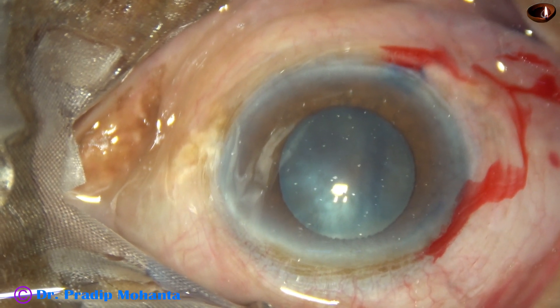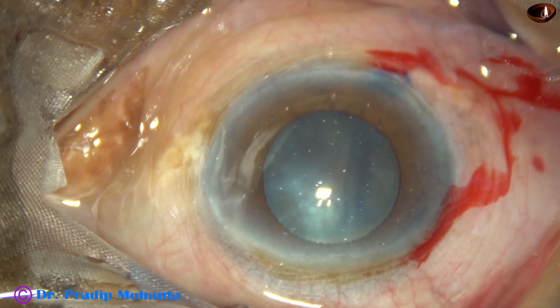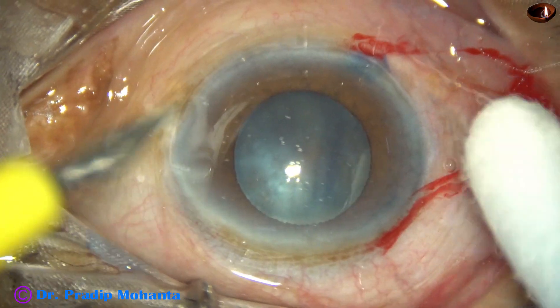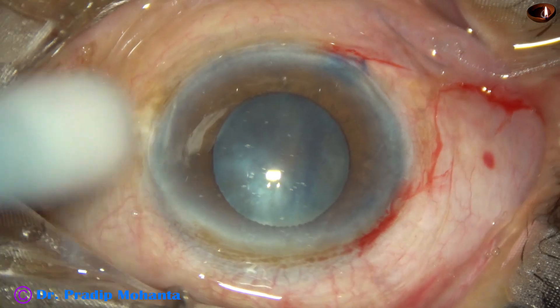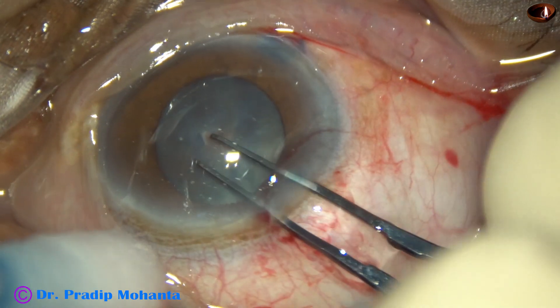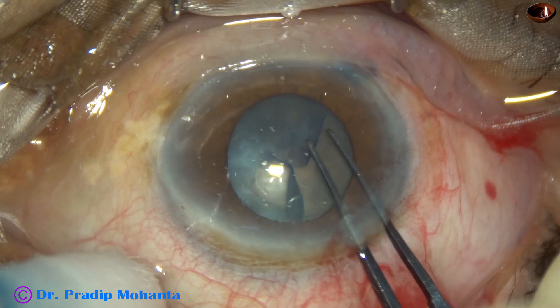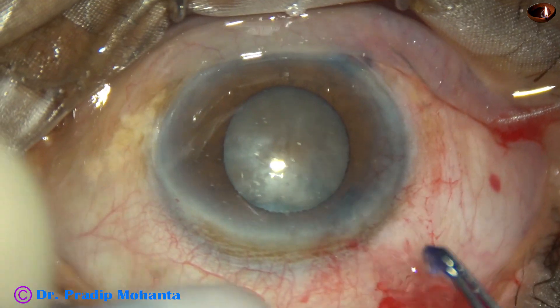Now is the time to do capsulorhexis and I am going to do it with the help of the Utrata forceps. One more side port is made on the left side of the main incision. Here goes the Utrata forceps. A capsular tag is raised by the tip of the Utrata forceps and guided in such a way that it just goes beyond the pupillary margin so that we get a rhexis a little larger than 4.5 mm.